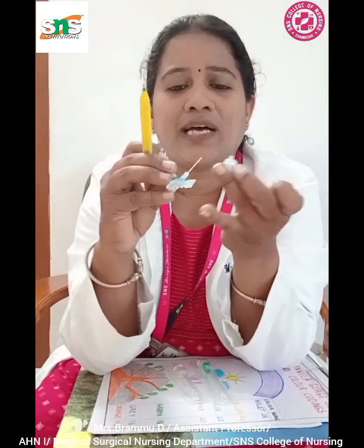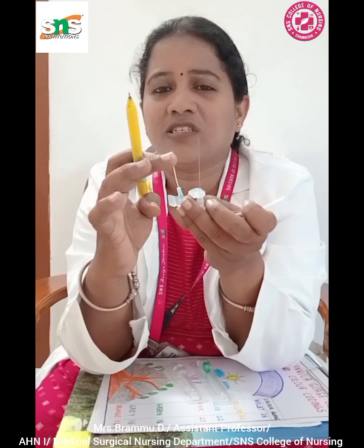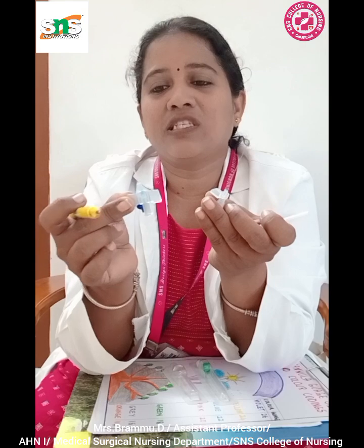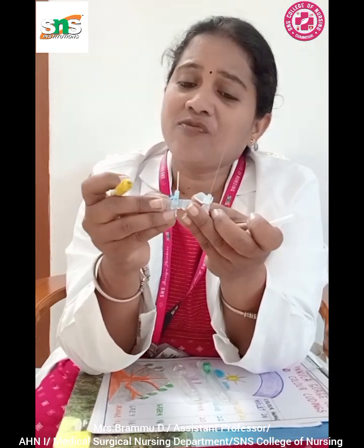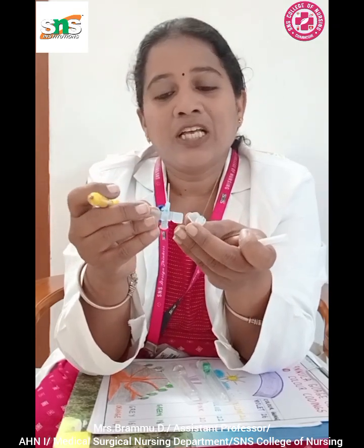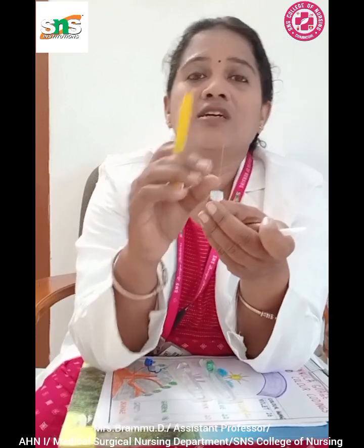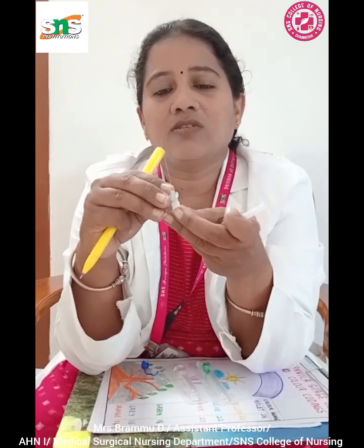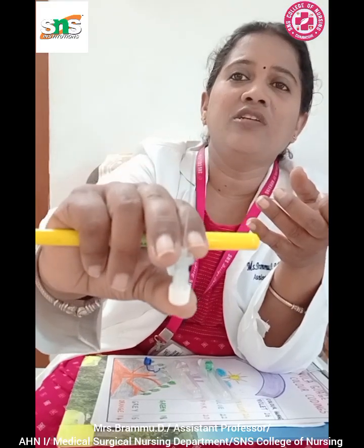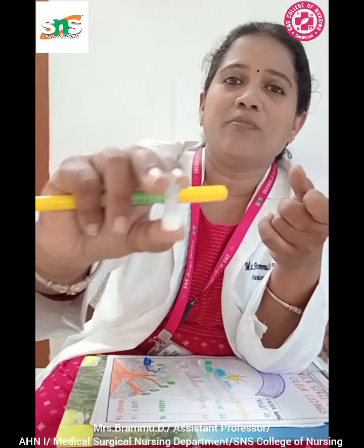So what is this catheter? This catheter is a flexible tube. As you can see, it is flexible and not going to poke the patient. It is a flexible tube that remains in the patient's vein, the intravenous line, facilitating smooth delivery of fluids or medications directly into the bloodstream. So the last is the needle. The needle serves as the initial puncturing point, creating the entry of the cannula into the patient's vein.